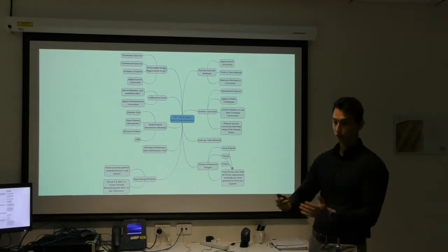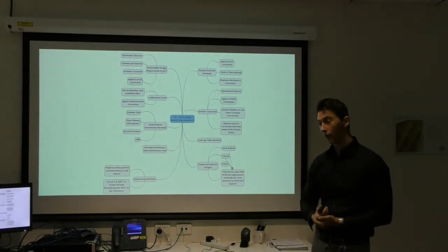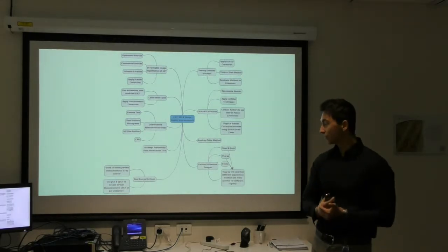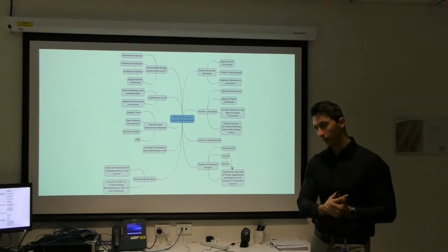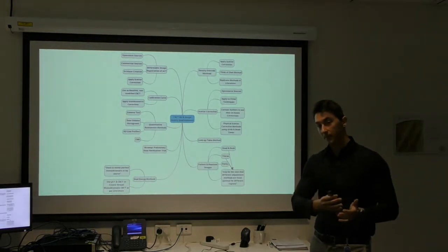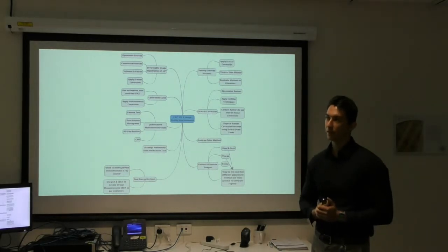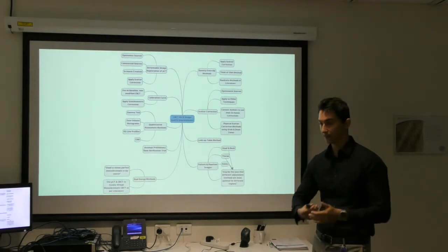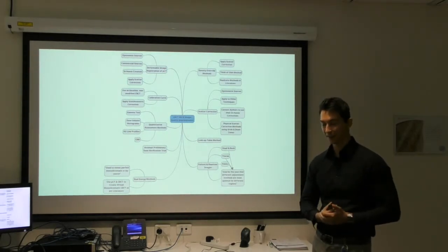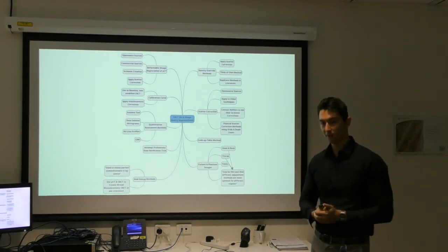Or you could do it the other way, you could deform the CBCT to the planning CT, but again that would induce some error. So I know other authors have addressed that by taking a planning CT within the same day. I could just take one of the first images, if a planning CT occurs on day 1 and a treatment occurs, I don't think it would occur on day 2, but as close as possible to the planning CT to minimize anatomical differences.